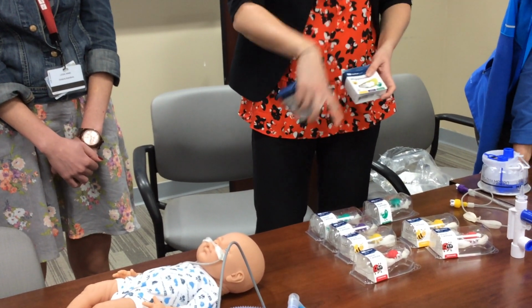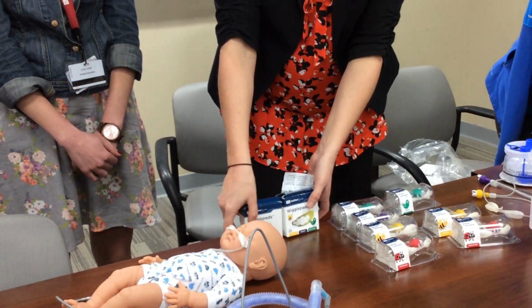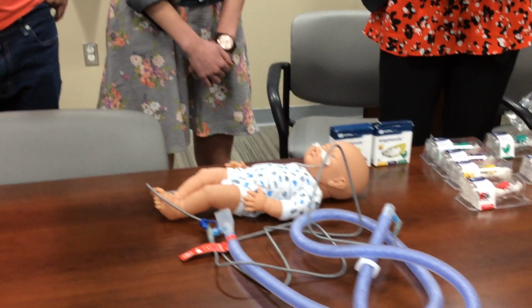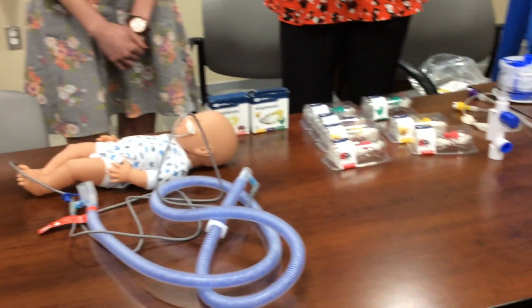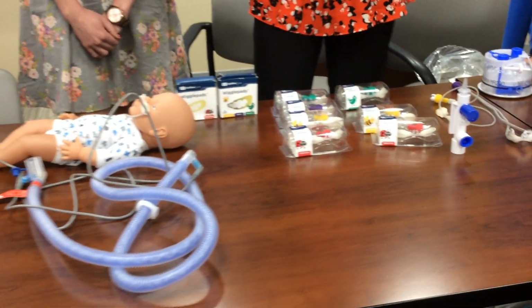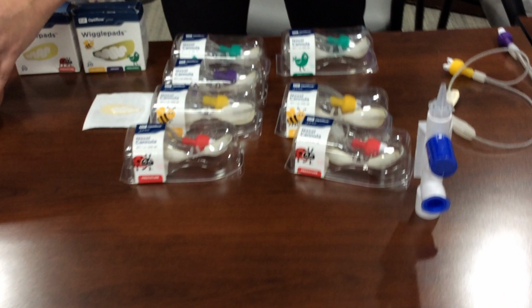So you have one size for these three here, and then one size for your preemie. Have you seen them in the ED yet? Do they stock them down there? No. Yeah, you guys don't have any. Theoretically they wouldn't be down there long enough to need a replacement pad.